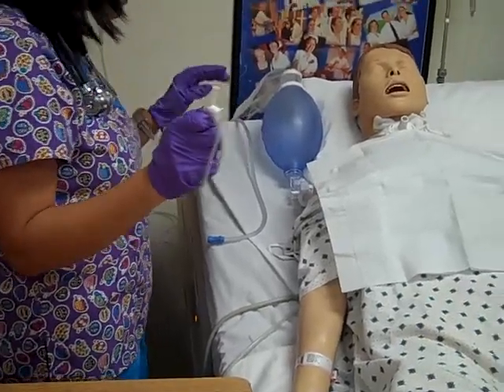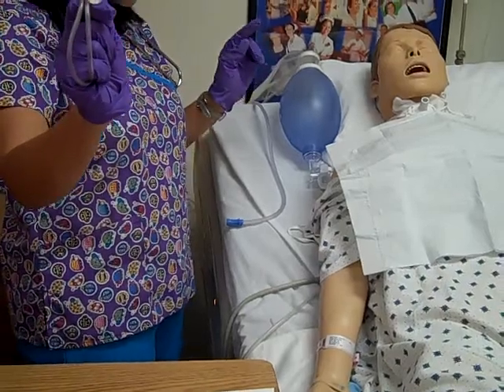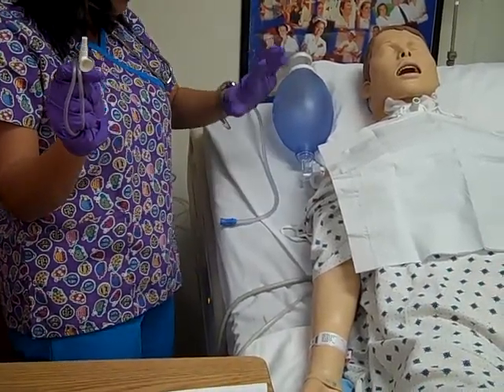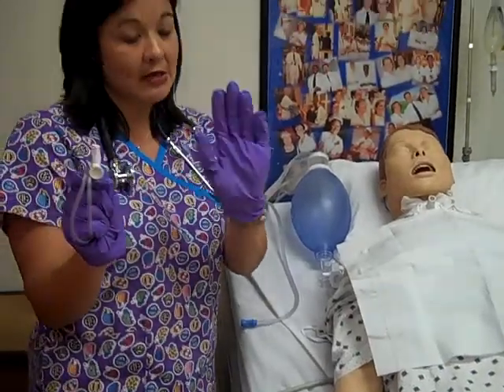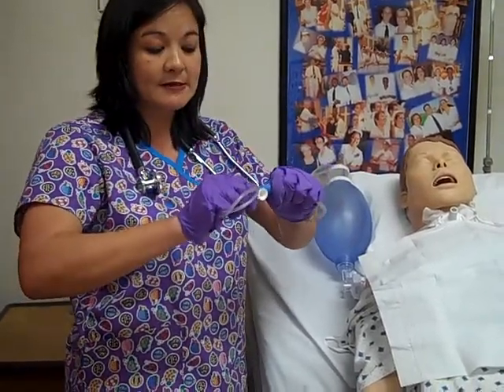I've hyperoxygenated my patient. Notice that when I connect this end of my catheter to my suction tubing, I'm going to be breaking sterility with that hand. So this hand becomes my unclean hand, and this is my sterile hand. I'm going to go ahead and connect it.